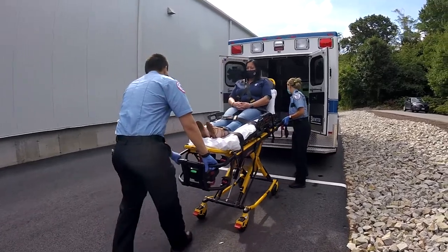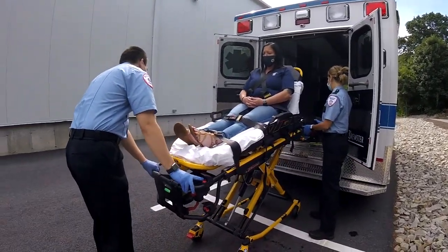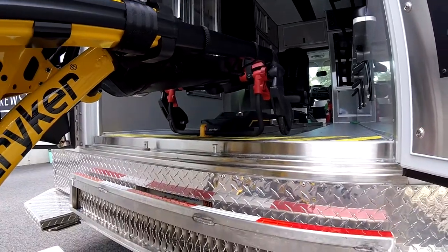For both types of stretcher, it is imperative that team members make sure that stretchers are locked or caught onto the ambulance prior to loading. This ensures that there are no instances of stretchers falling out of ambulances.